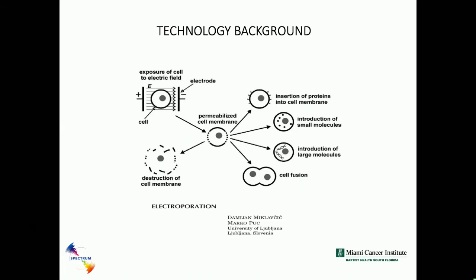It can be used both in the surgical environment as an open procedure or laparoscopically by a surgeon, or can be done percutaneously with image guidance, which is what I do. Next slide, please.